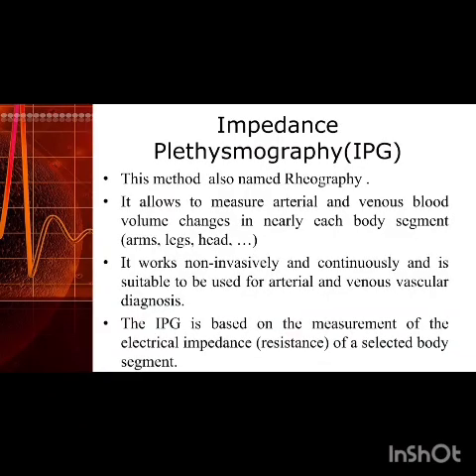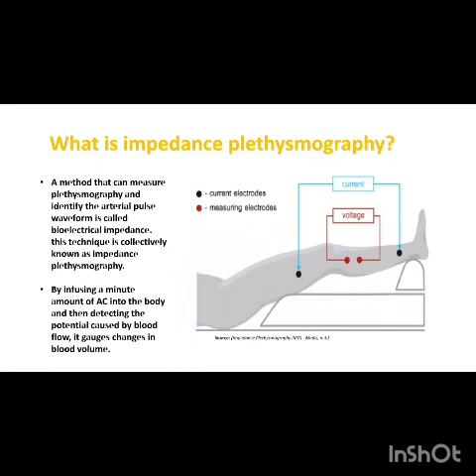Impedance plethysmography is a non-invasive technique that measures changes in electrical resistance in the body to assess blood volume and blood flow. It can be used to evaluate the heart, lungs and peripheral vascular system.